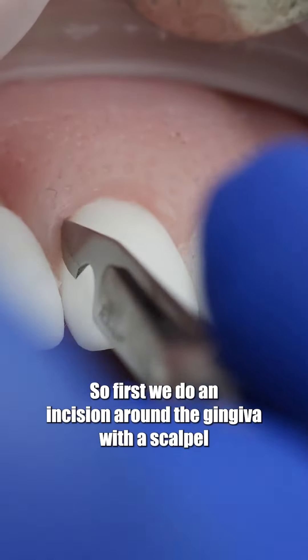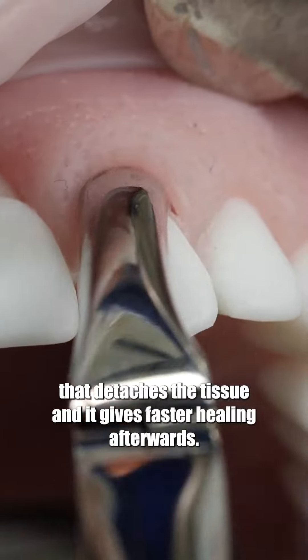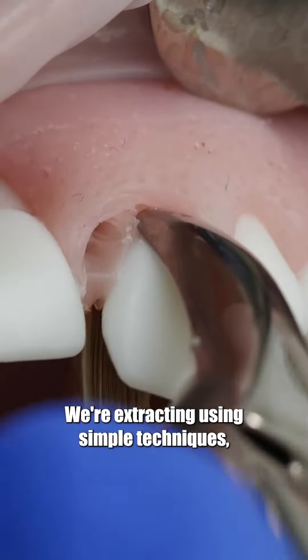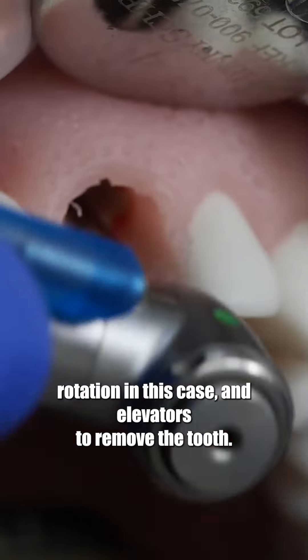First, we do an incision around the gingiva with a scalpel that detaches the tissue and gives faster healing afterwards. We're extracting using simple techniques — rotation in this case — and elevators to remove the tooth.